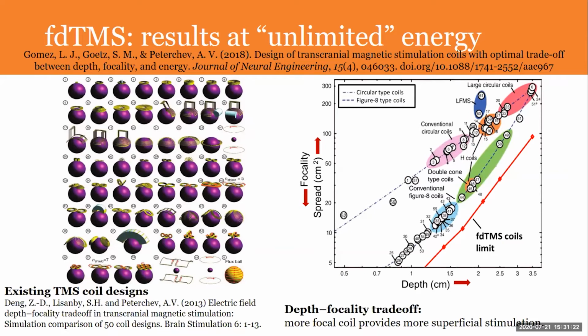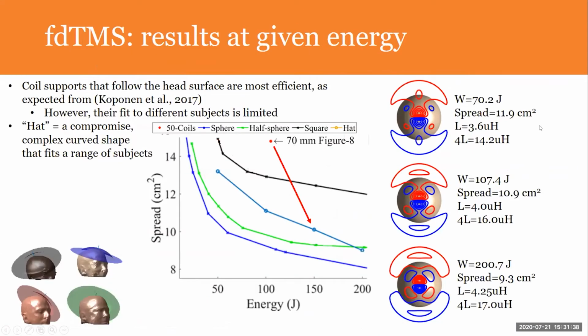This is the case for unlimited energy, where the energy is being increased higher and higher, and you actually see that for finite coil size, even with that, there will be a limit. And then if we limit the given energy, we can approach that limit. So these will converge to the limit of the previous slide in spread. There is a commercial coil. So we can roughly halve the spread if we give some slack on our efficiency.